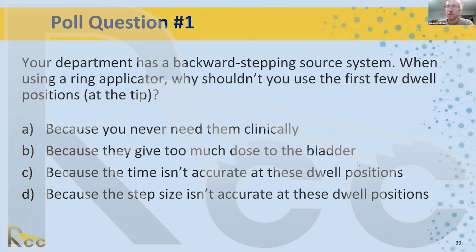And great. So most of you got it right. The answer is D, because the step size isn't as accurate as these dwell positions.